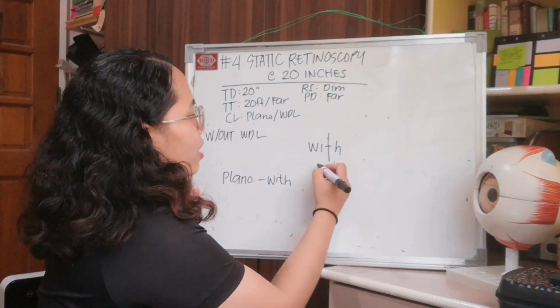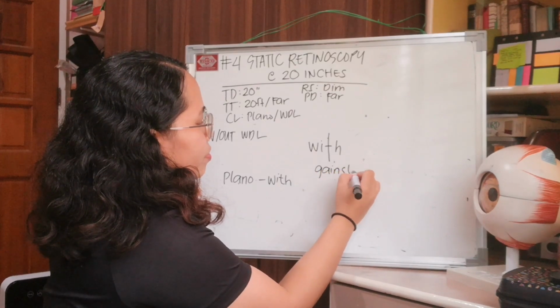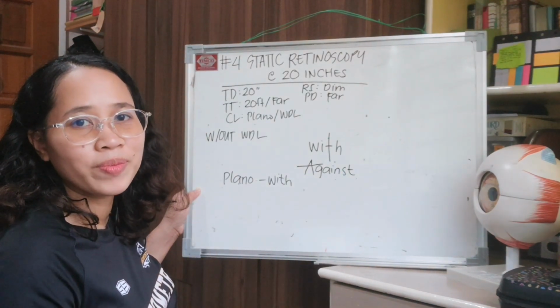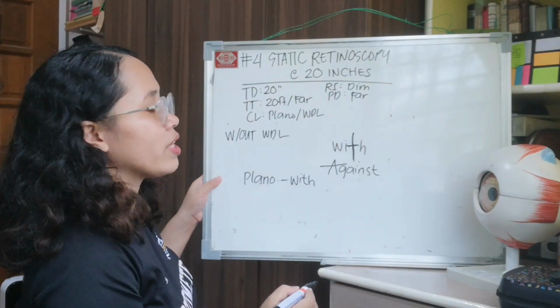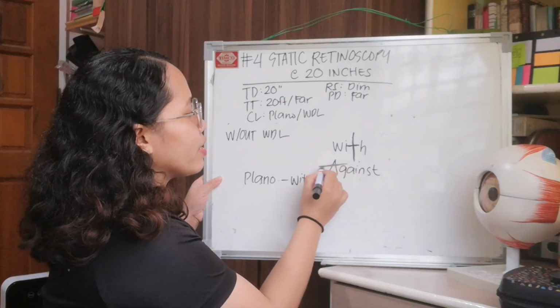If it's against movement, you use minus. Sorry, did I make it with plus? With movement, plus lens. Against movement, minus lens.